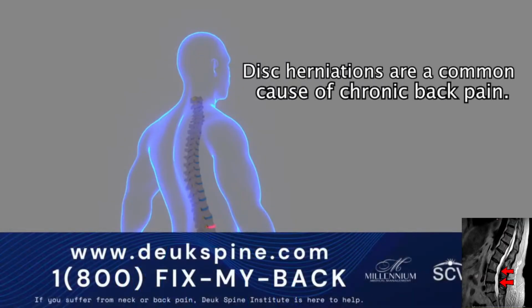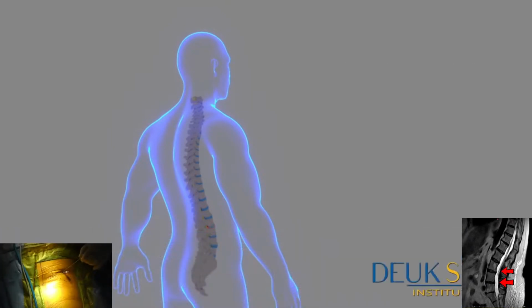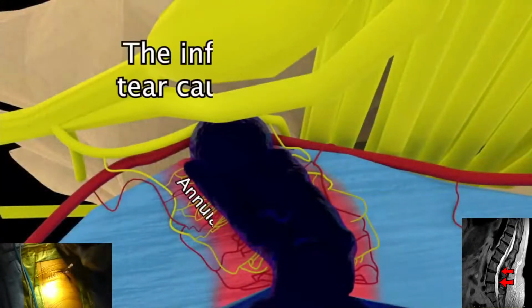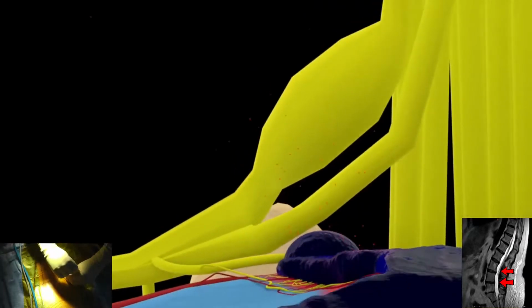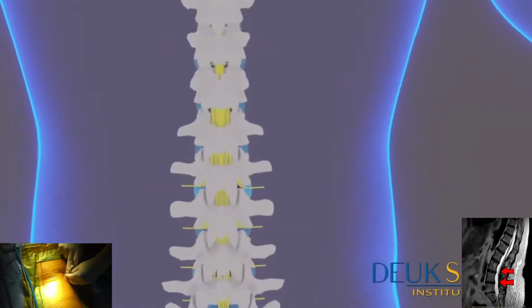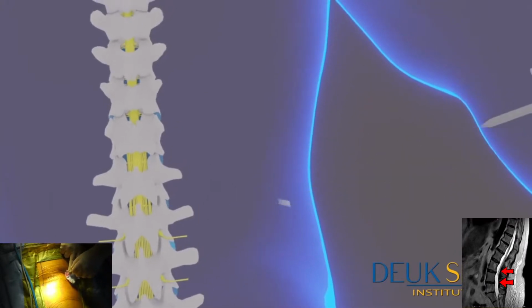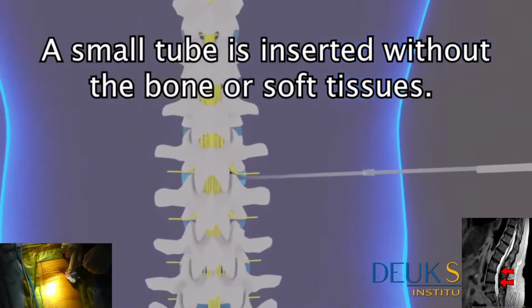Disc herniations are a common cause of chronic back pain. The inflamed annular tear causes back pain. Inflammation of the nerve roots causes leg pain. A Band-Aid-sized skin incision is made. A small tube is inserted without damaging the bone or soft tissues.